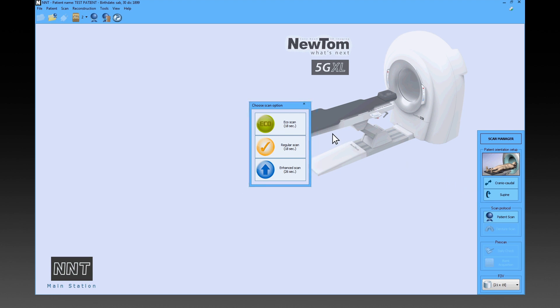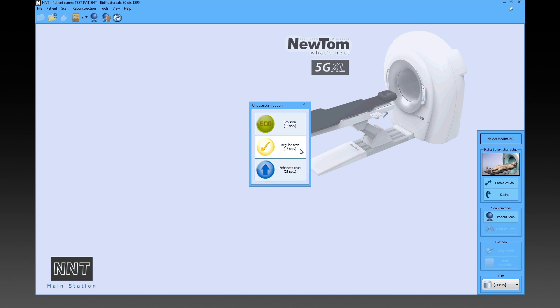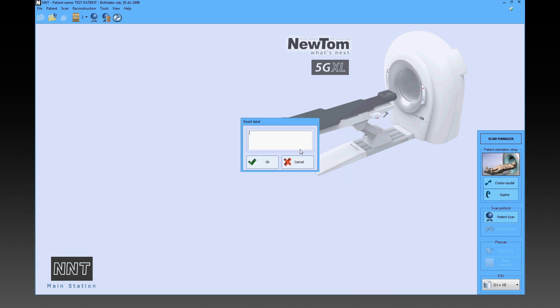EcoScan is recommended to examine pediatric patients due to the limited dose and for post-op follow-up examinations. Enhanced Scan provides even higher quality than the regular protocol but with a higher dose and longer exposure time. While data capturing screens are displayed, the NNT software always supplies the directions to follow.